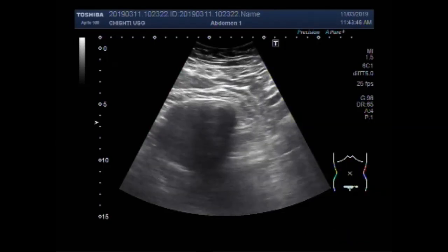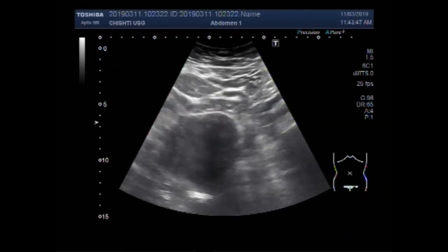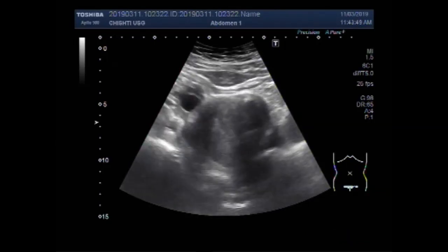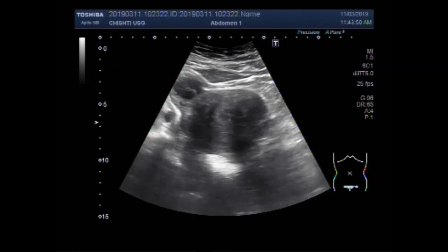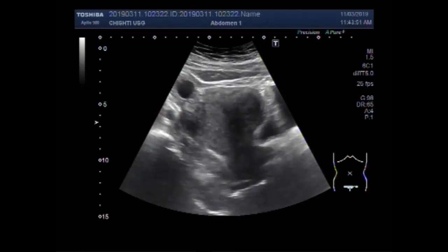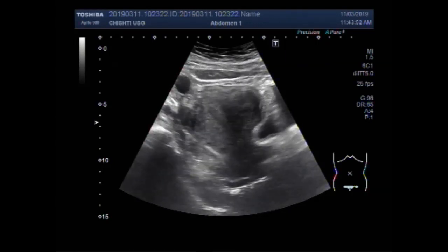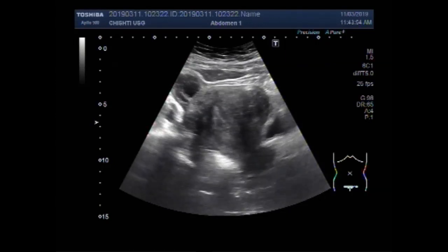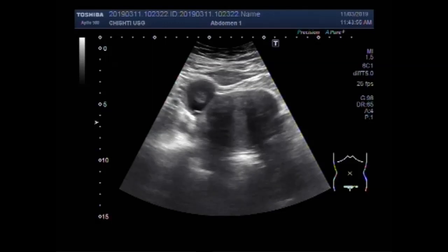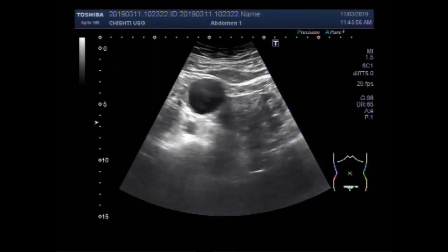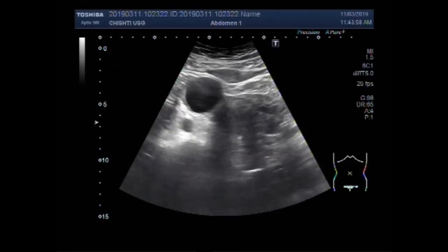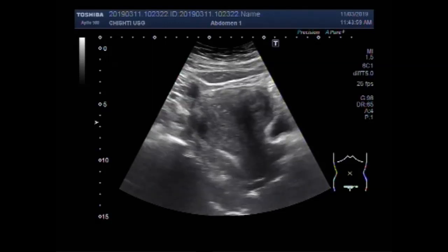This ultrasound video shows two uterine masses and an ovarian cyst. You can see the uterus having two masses and an ovarian cyst.